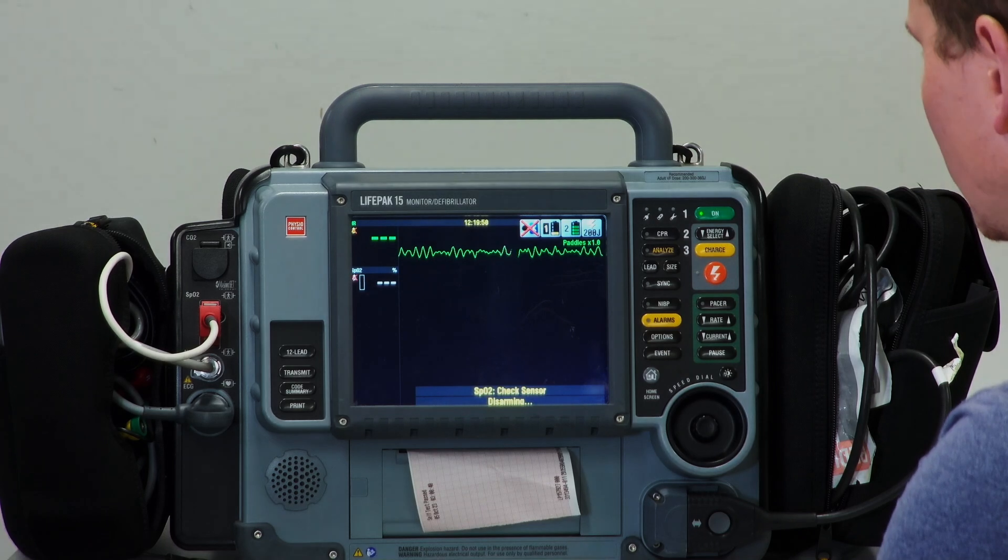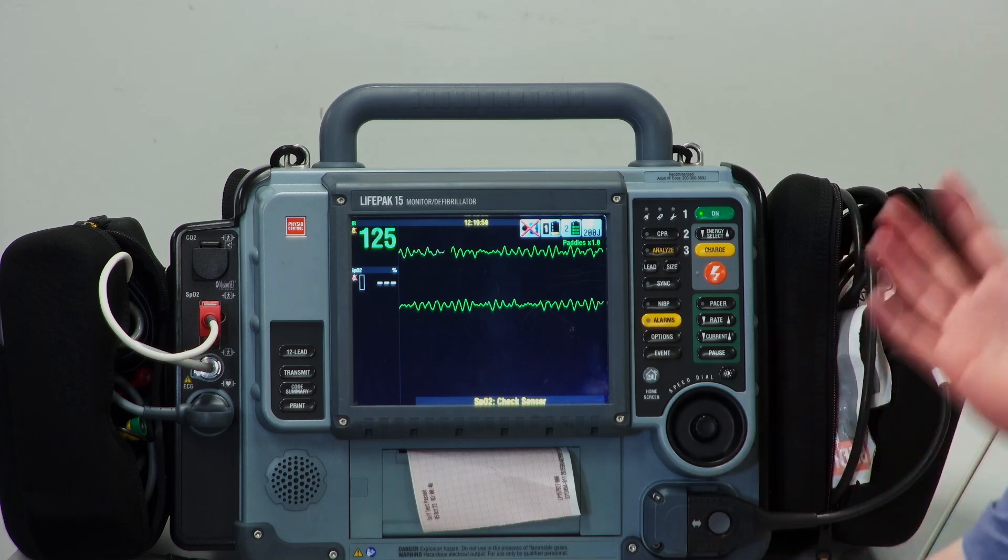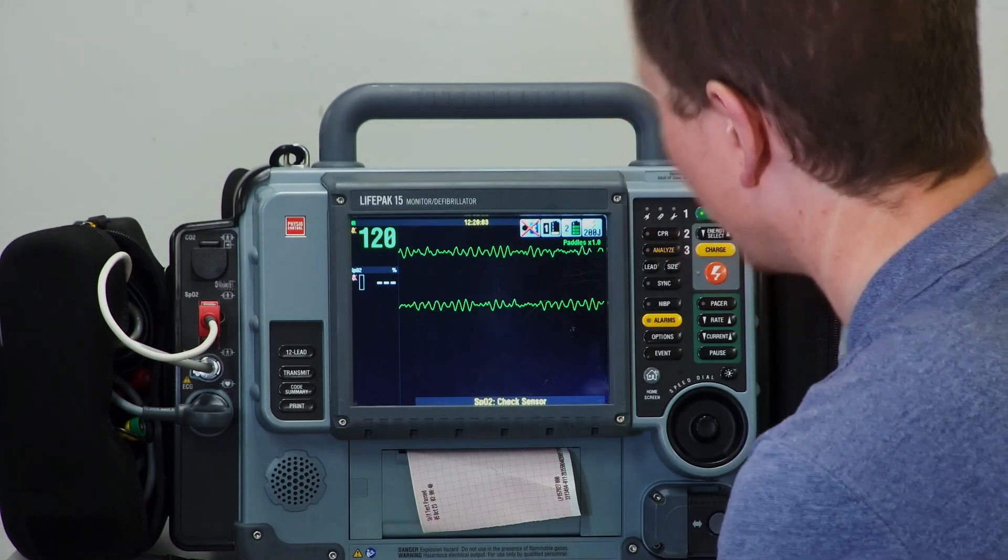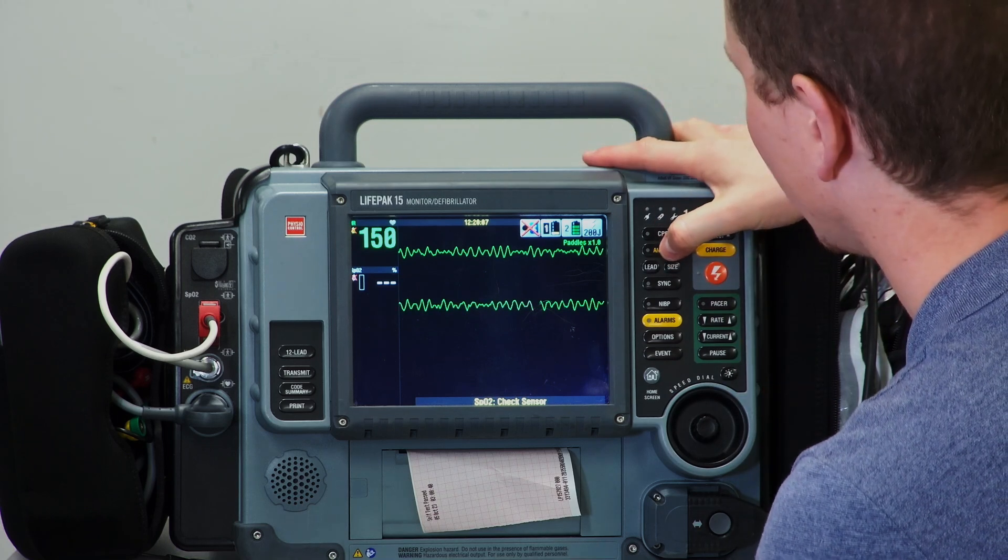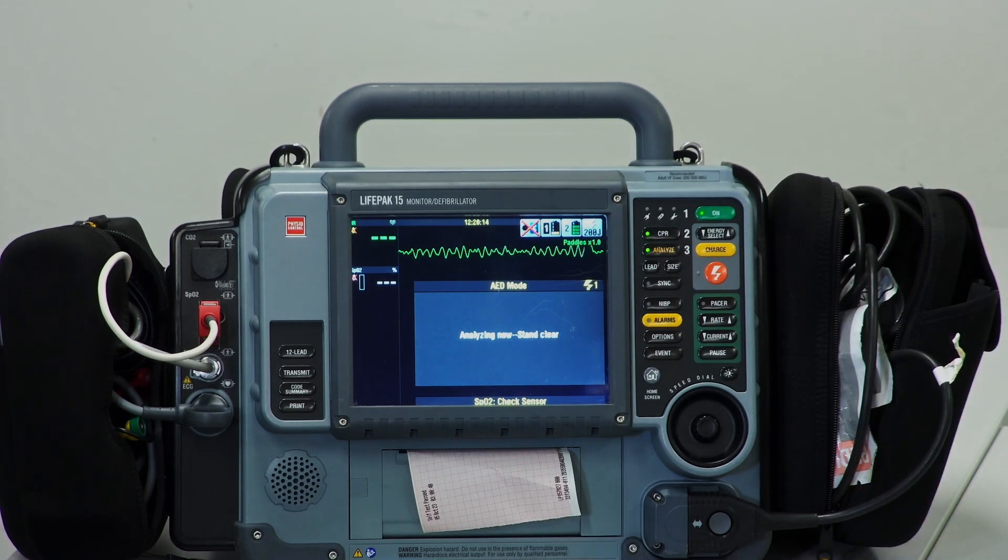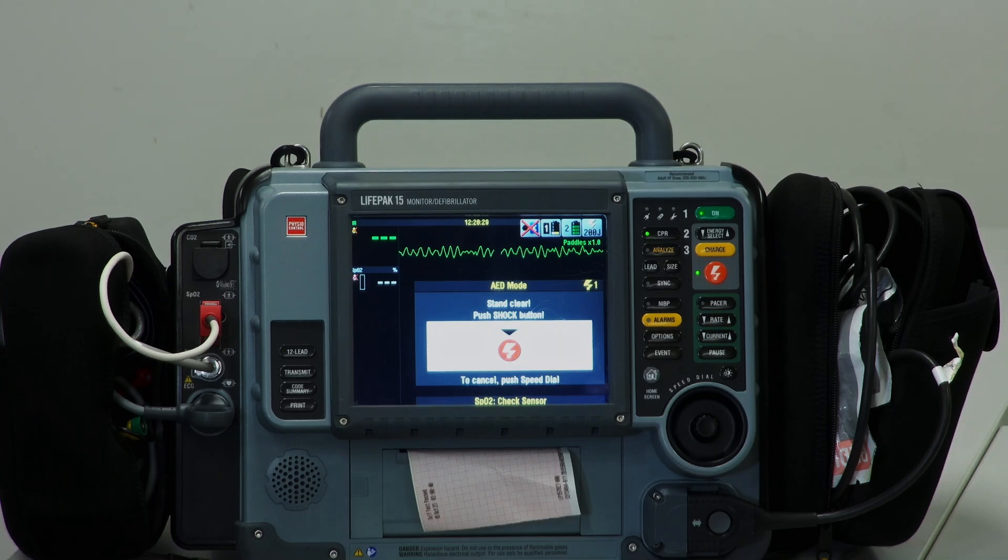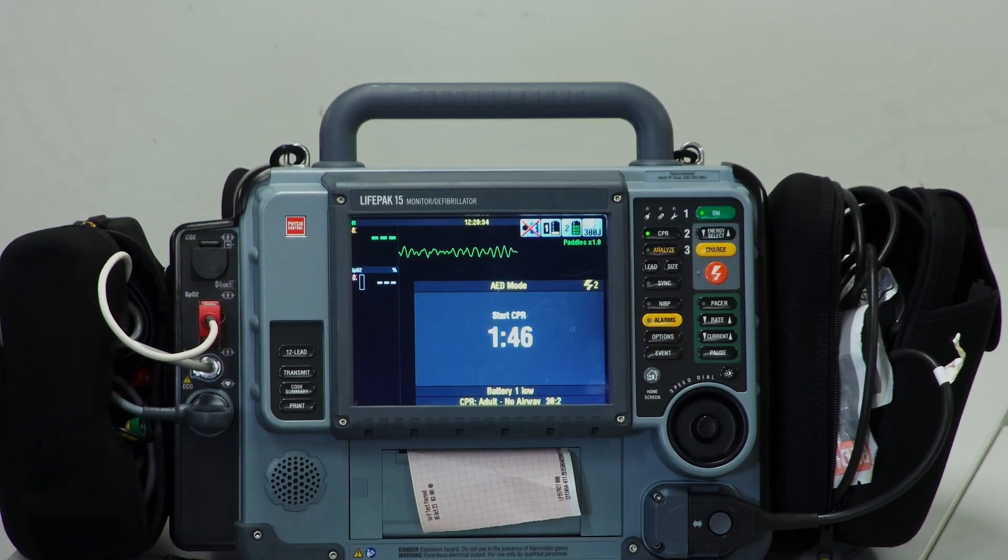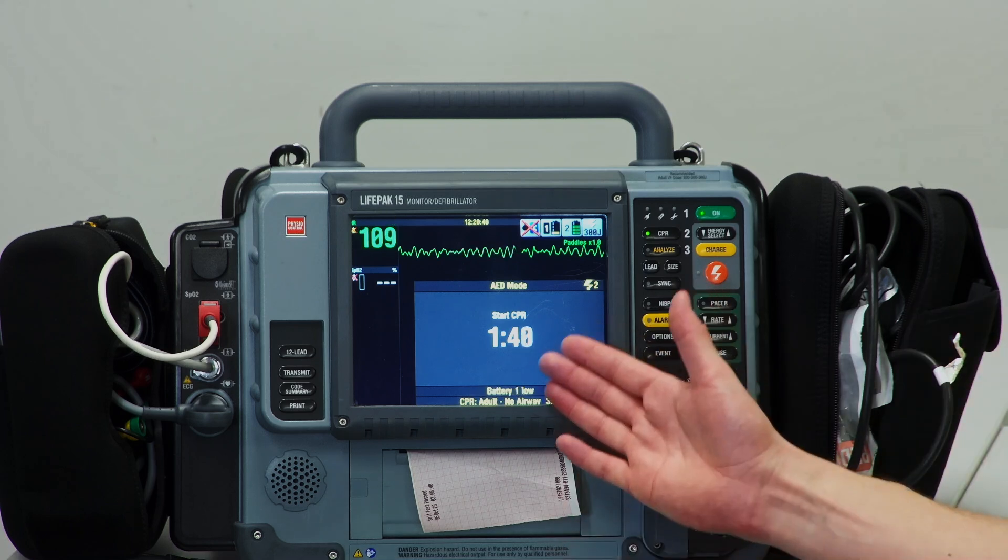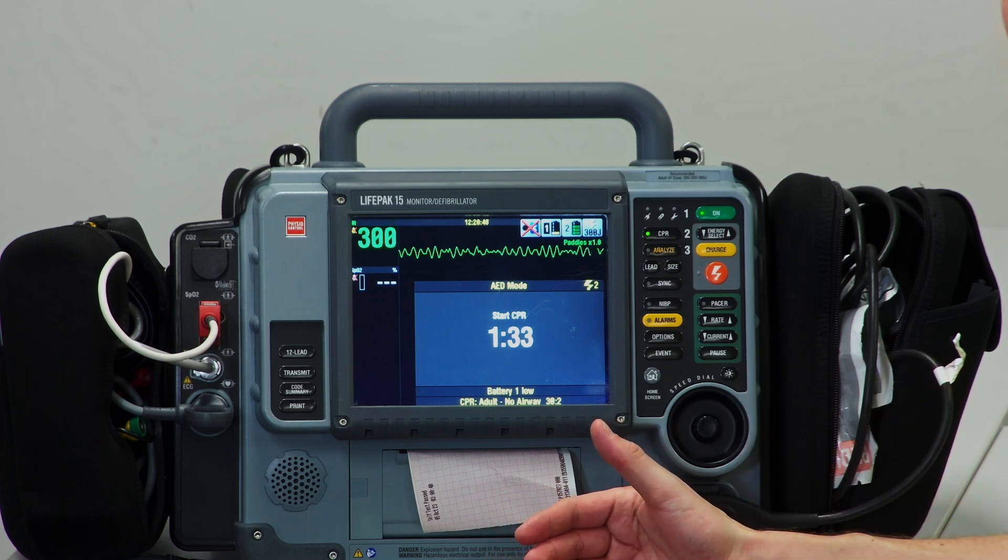If we go into AED mode, this machine can function as an AED. It's very noisy so I'm not going to be able to speak over it, but I'll demonstrate. If you just hit the analyze button, it jumps into AED mode. Analyzing now, stand clear. Shock advised. Stand clear, push shock button. Now we can step in and hit the shock button. Start CPR—and all of a sudden the metronome turns on and we have a timer. At the end of the timer it's going to tell you to reanalyze and then tell you whether you need to be shocking or not.